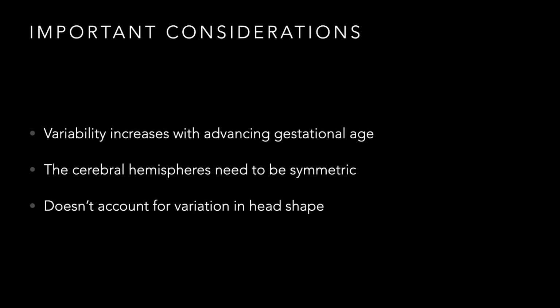So a couple of important considerations: variability increases with advancing gestational age. We've seen this to be the case in every other metric that we measure. It's most accurate earlier on, and it becomes less accurate as pregnancies develop, right? And the reason for that is, early things are pretty consistent.